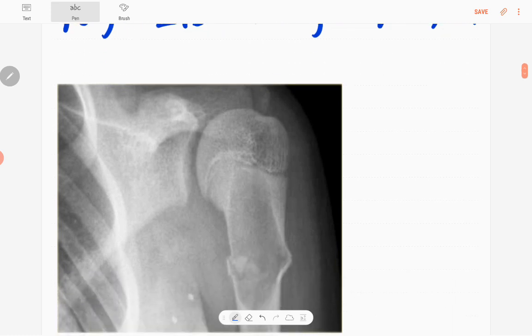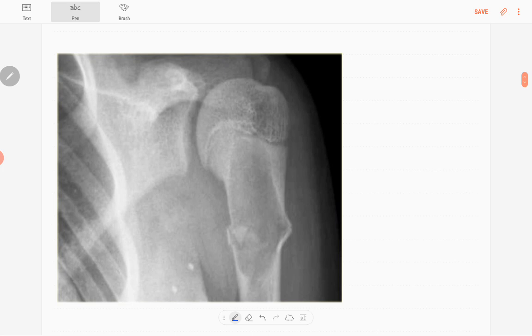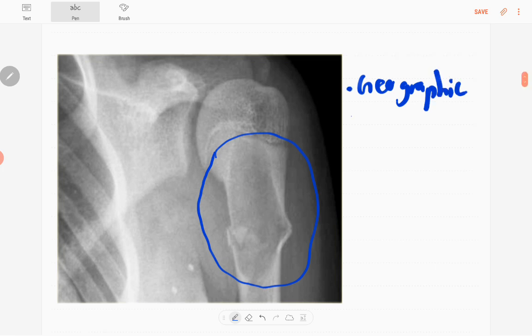This is the X-ray of that child — an anteroposterior radiograph of the left shoulder joint in a skeletally immature patient. You can see the obvious abnormality here; this region is normal. The lesion is a well-defined or geographic type of lytic lesion in the metaphyseal region of the left upper humerus.